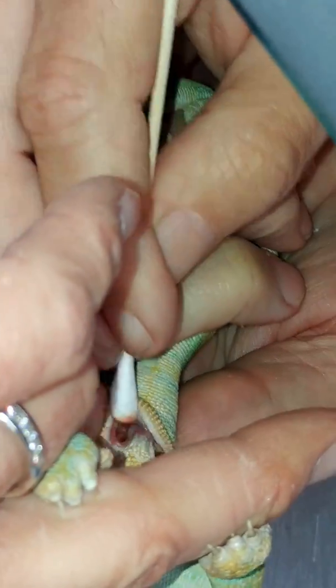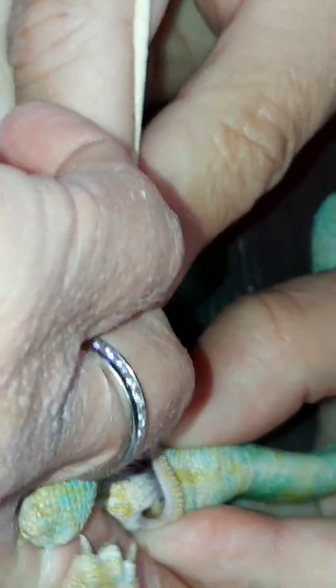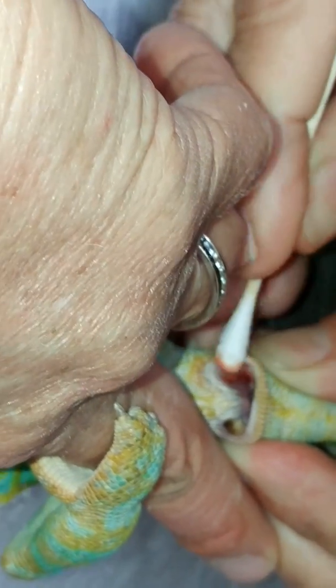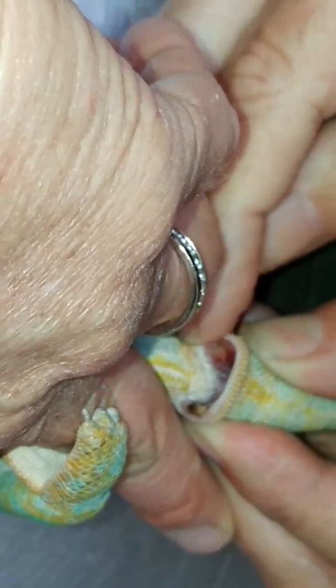On the other side — I just want to note that this one looks like it has one too. I think this one is the concerning one, but this one also appears to have one. Okay, let me get them.